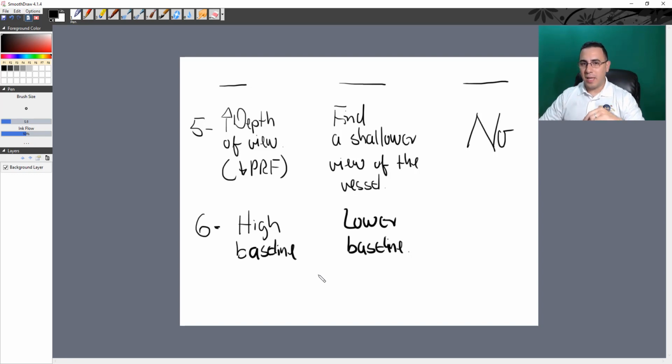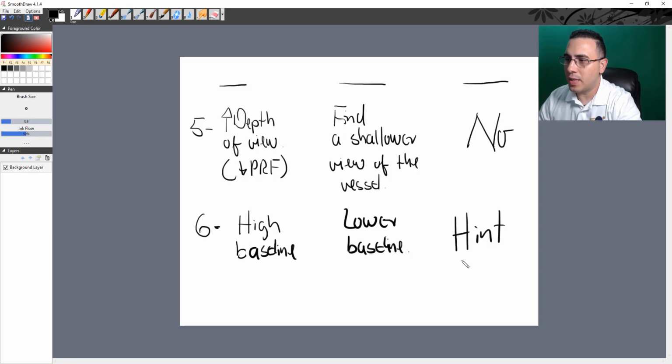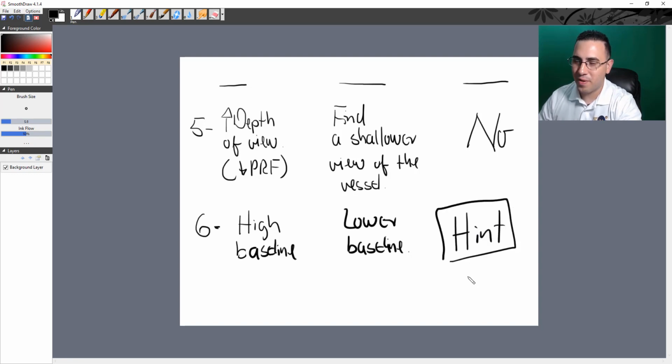So be careful with the baseline, because the baseline sometimes makes your waveform look nicer, but then the problem that gave you the aliasing in the first instance is still there, right? Okay, so the problem with the baseline is that one. So be careful with this one. So I'm just going to type in here, write down a hint: remember, before using the baseline to fix the aliasing or the appearance of your waveform, fix the mistake that gave you the aliasing in the first instance.